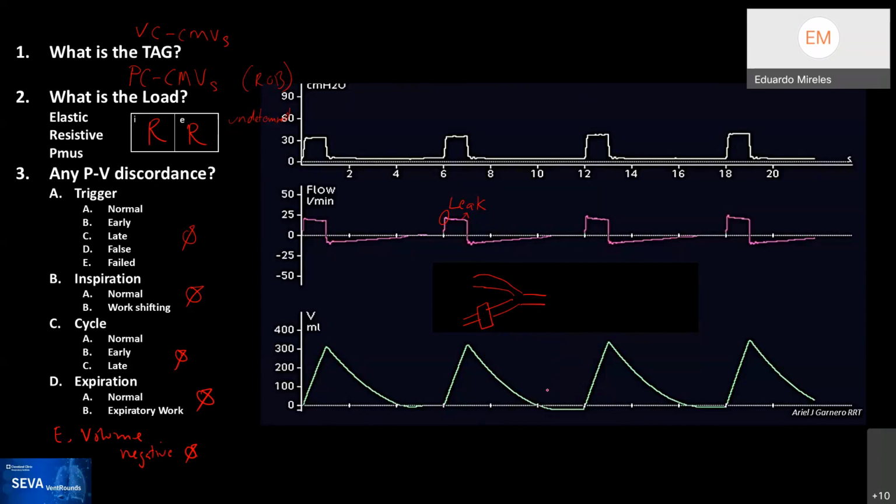Yeah, without seeing what he actually did, it's hard to say. But that is a confusing point. You would expect that the exhaled volume would be less than the inhaled volume because it's counting the leak volume, right? I don't know why it's not. It must have something to do with the placement of the flow sensor. Yes, sorry for being late and for interrupting. This is one of my tricky experiments. I think I put the HME before the flow sensor, after the Y.